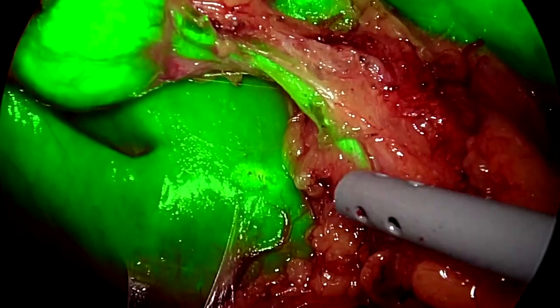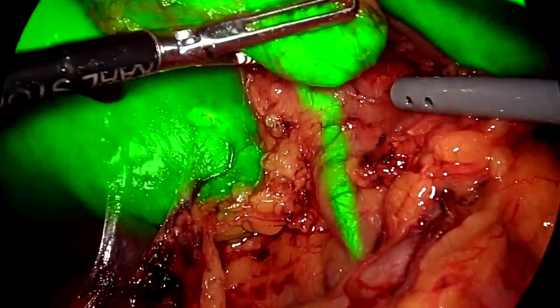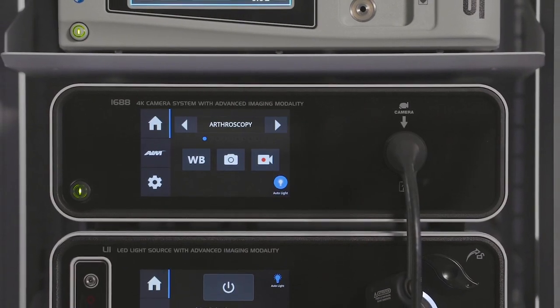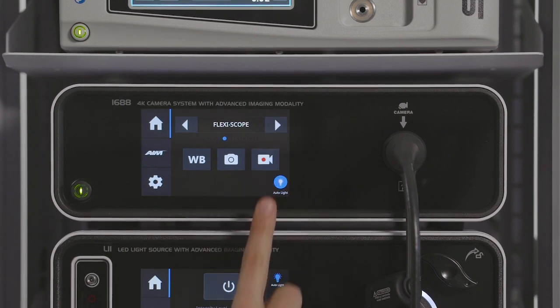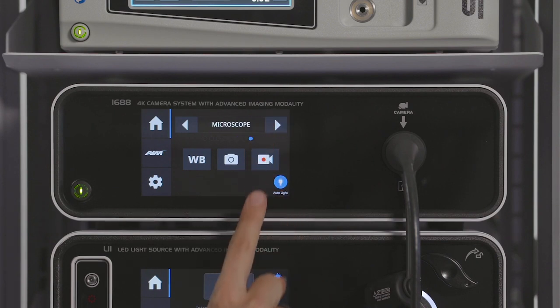Stryker's 1688 AIM 4K camera produces brilliant visualization for use in minimally invasive surgery. This is the camera control unit, which displays the current surgical specialty and provides access to common camera functions. The 1688 AIM 4K camera has optimized image settings for nine surgical specialties. Use the arrows to scroll through the specialties.